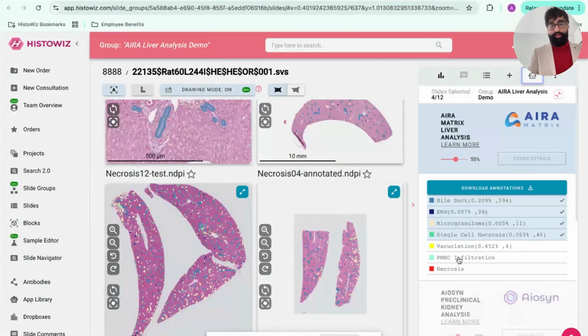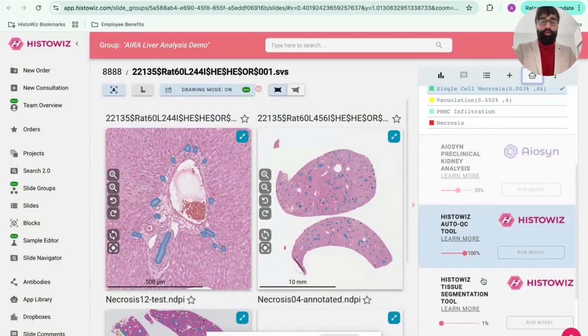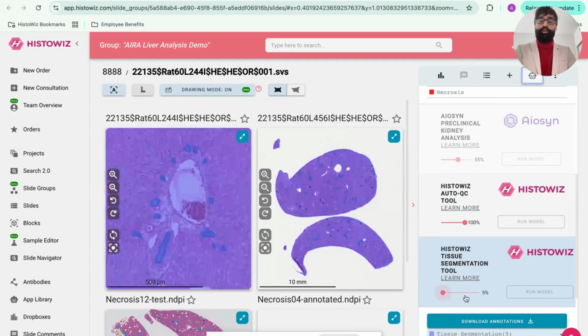And another very interesting takeaway is that through AI orchestration, you can cross play across multiple apps simultaneously. Now, what do I mean by that? Say you're interested in, for example, HistoWiz tissue segmentation tool, and you're interested in AIRA Matrix liver analysis.